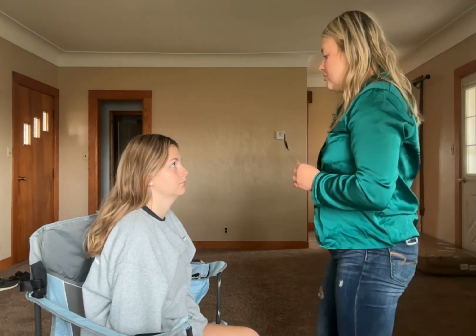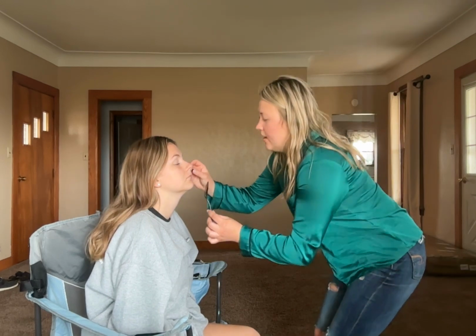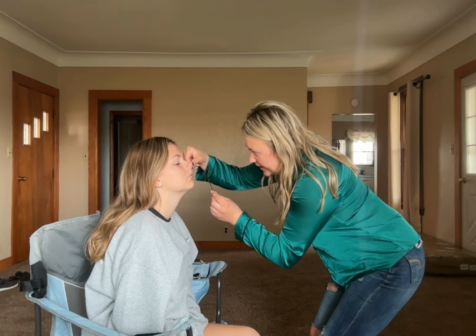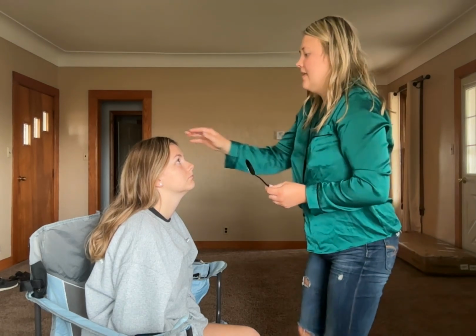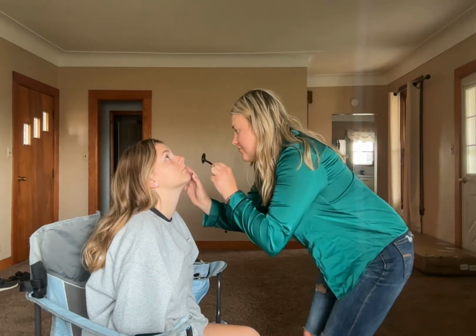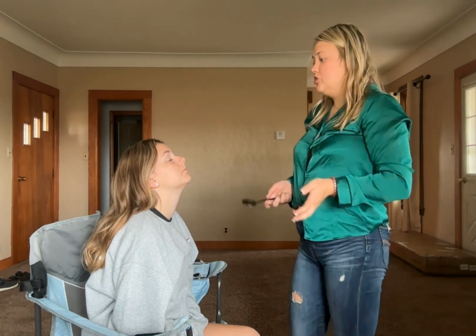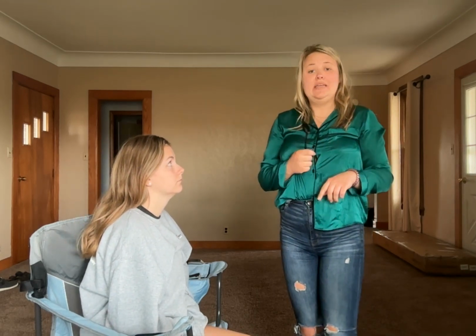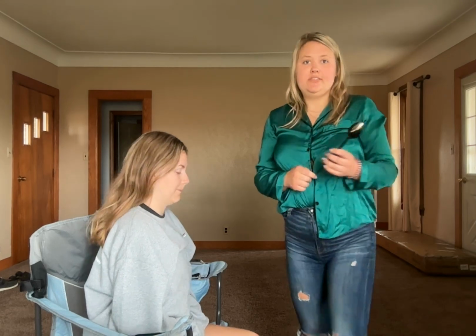I'm gonna take my otoscope. I would avoid putting pressure on the septum, and I would gently have you just tilt a little bit, and I would look in both sides of her nostrils, centered like this, and then head back so I can get a different angle and look. Both sides are reddish pink in color. There's no drainage, no foreign bodies, no bleeding. There's no abnormalities. It looks good and it's moist.